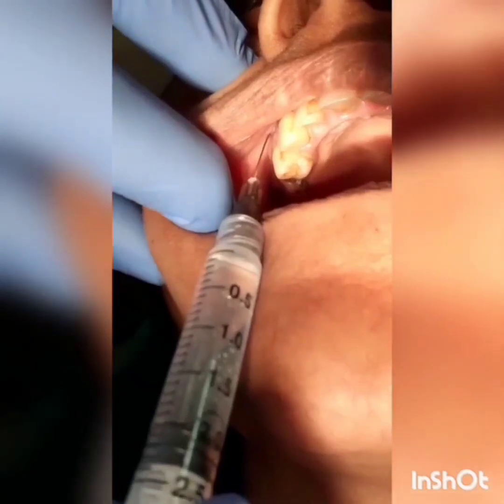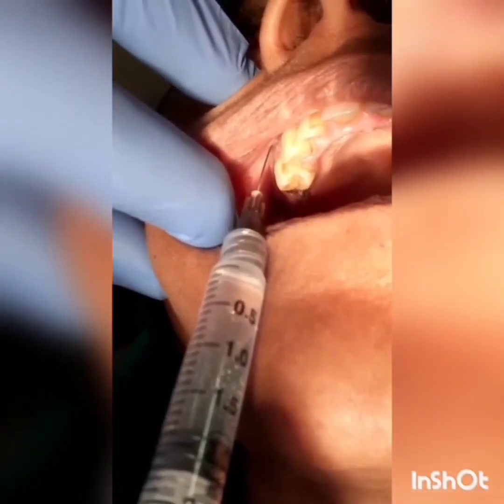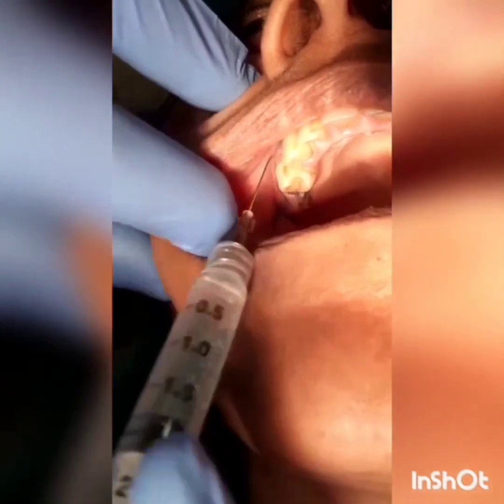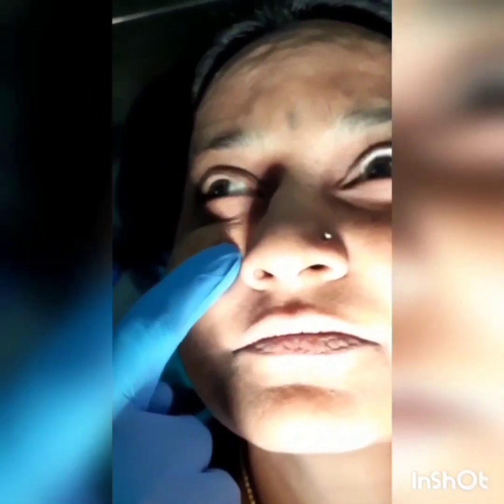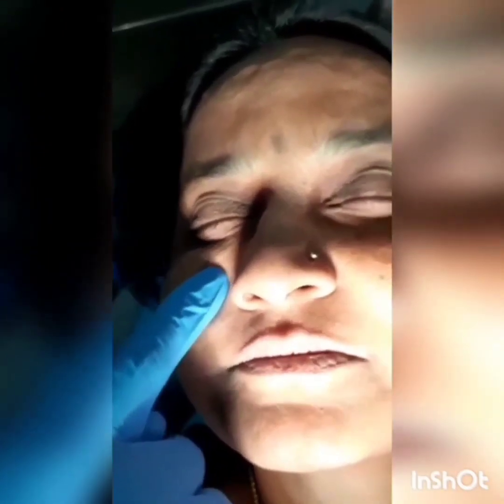Then you apply gentle pressure on the infraorbital foramen area so that the fluid diffuses into the foramen and anesthetizes the anterior superior alveolar nerve.